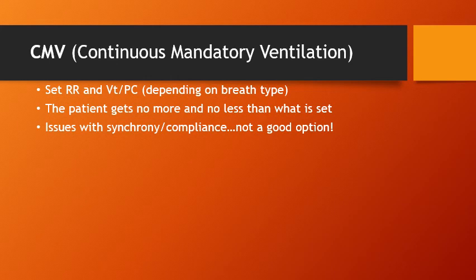But in our environment, this mode creates issues with synchrony and compliance. So it's not a good option for us to use in the transport and pre-hospital environment, because if the patient wants to get more breaths and is trying to breathe over the ventilator, it will not allow that, and so the patient just won't be compliant with the ventilator.